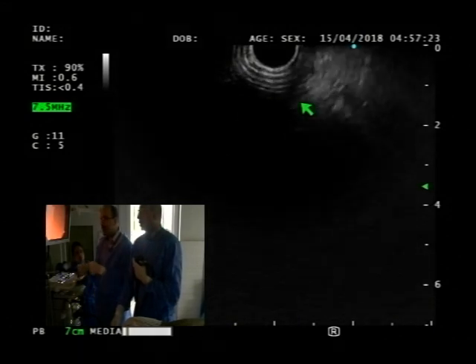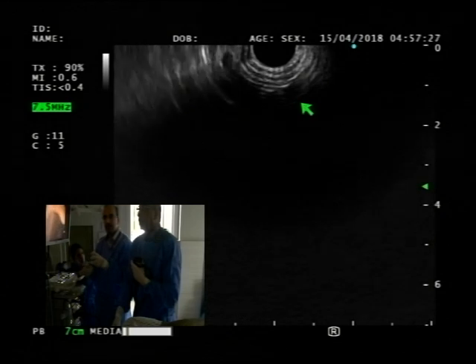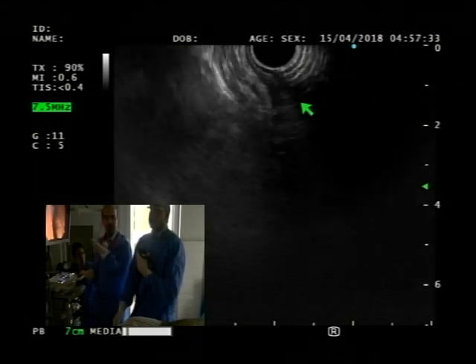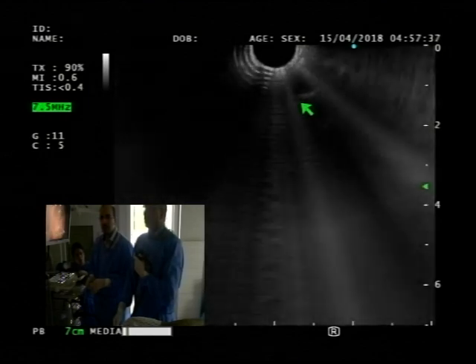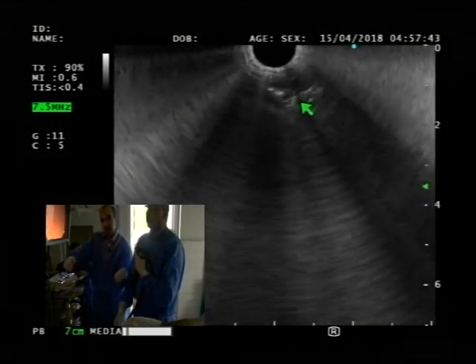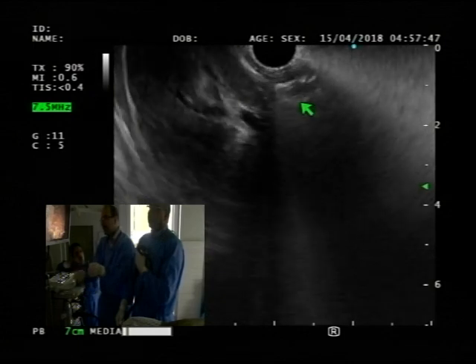That isn't essential at this stage early on, because most people at this stage are taught to just follow it as far as you can take it, and then go to the bulb and do your second sort of view next. So what I would suggest is, how far do you go in the stomach? You can go to the pyloric channel, suction, turn clockwise towards the back wall. And now you can pull back.